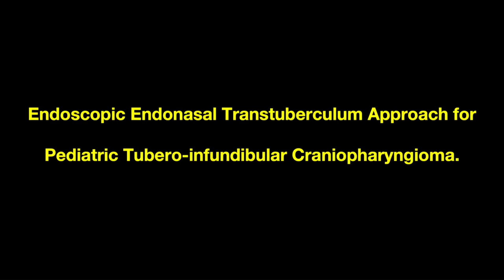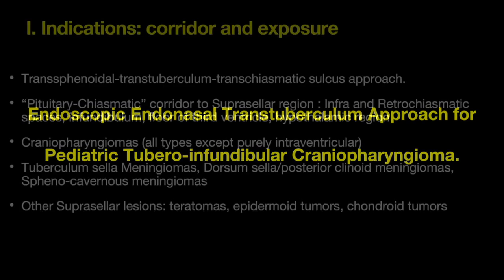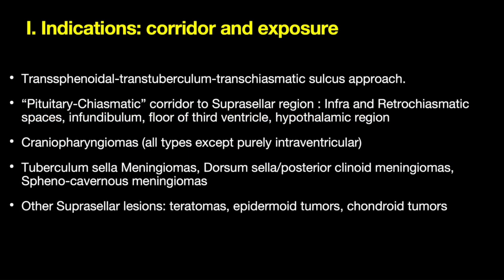This is the surgical video of an endoscopic endonasal approach for a pediatric craniopharyngioma. The approach can be described as transsphenoidal, transtuberculum, and transchiasmatic sulcus approach. It provides a pituitary chiasmatic corridor to the suprasellar region. Both the infra- and retrochiasmatic spaces, the infundibulum, the third ventricle, and the hypothalamic region can be accessed. This is ideal for craniopharyngiomas — all types except purely intraventricular — also for tuberculum sellae meningiomas and other suprasellar lesions.